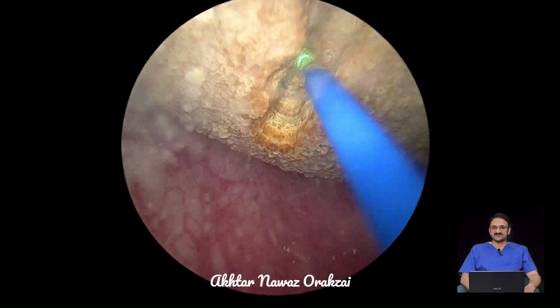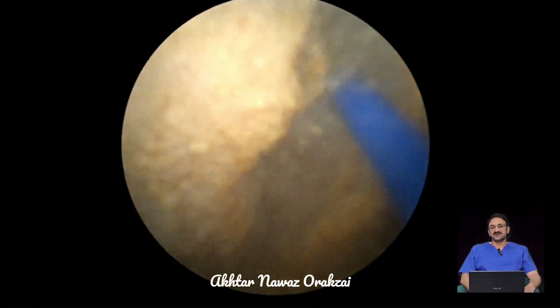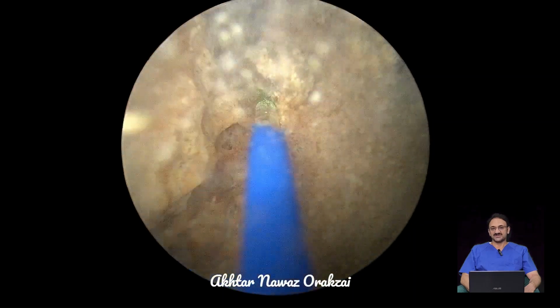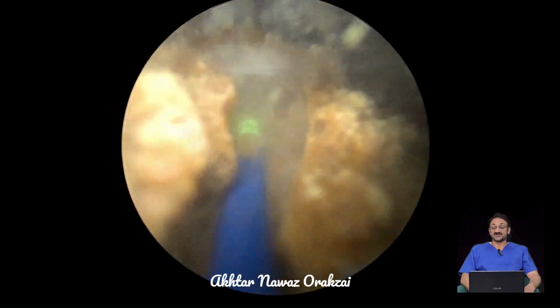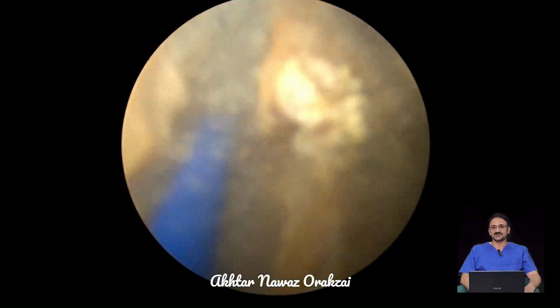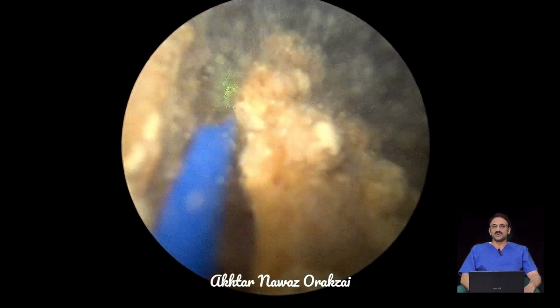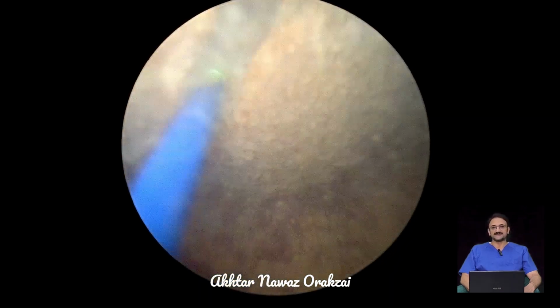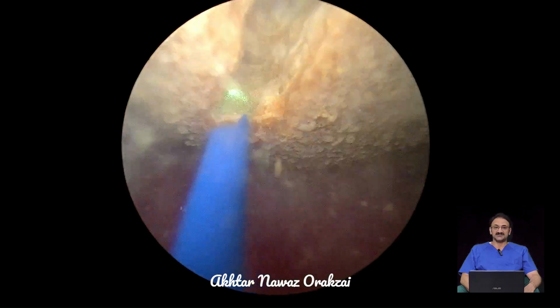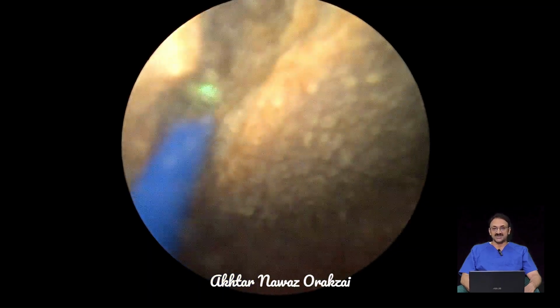Upon investigations, his prostate was around 45 to 50 grams with a median lobe, but he had a large stone of 4.2 centimeters, and on the X-ray pelvis, the stone was rounded and large. So we counseled him about the procedure: we will do cystourethroscopy, and then we will decide whether to go for cystolitholapexy or a percutaneous cystolithotomy, or even an open vesicolithotomy.